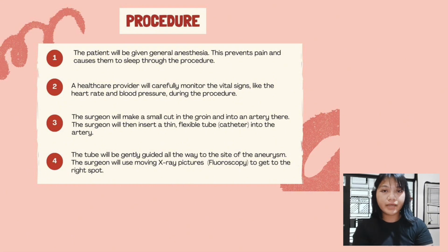A healthcare provider will carefully monitor the vital signs, like the heart rate and blood pressure, during the procedure to assess their physiological status and identify any potential complications that might arise during the process.